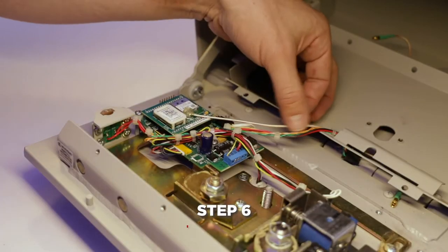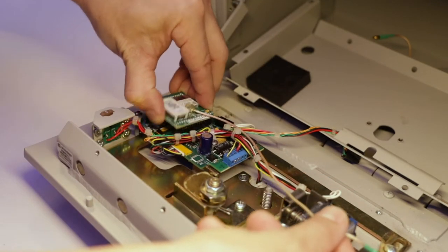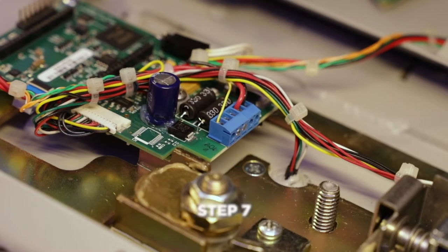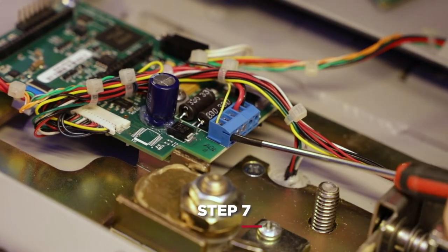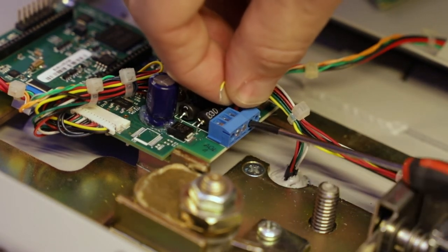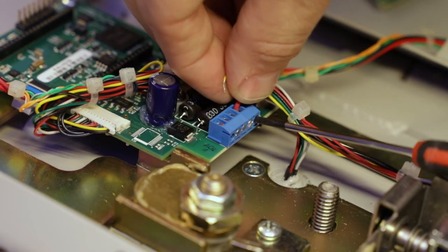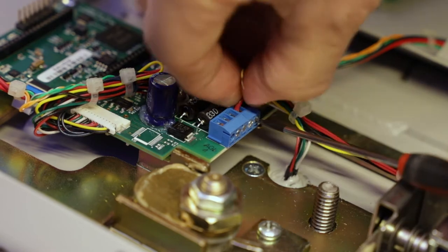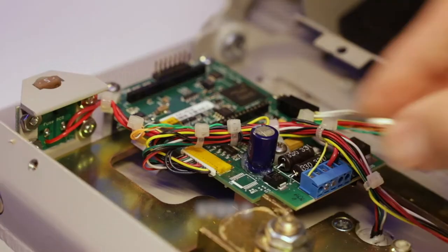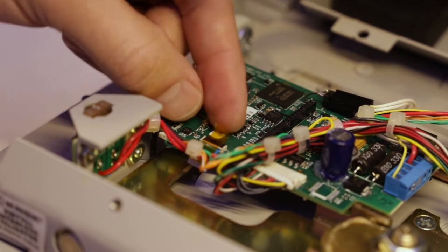If your Medvault is equipped with Wi-Fi, remove the top Wi-Fi board gently by rocking it back and forth. Next, disconnect the lead wires. Use the screwdriver to loosen the screws on the terminal block and remove all three wires.